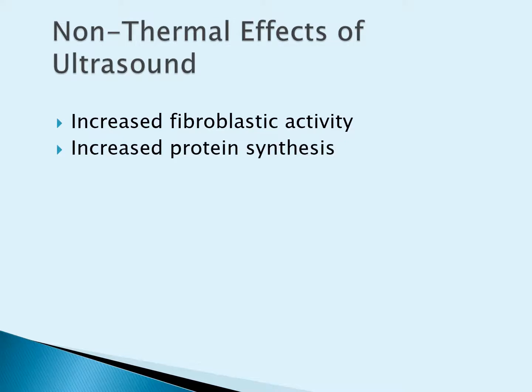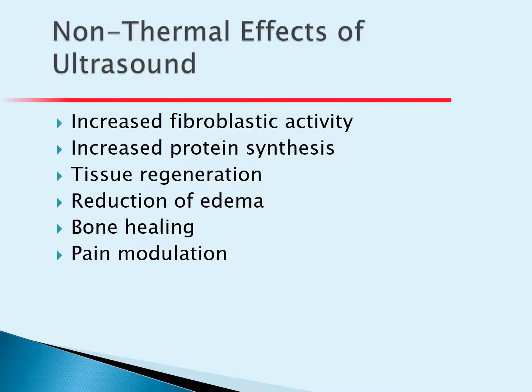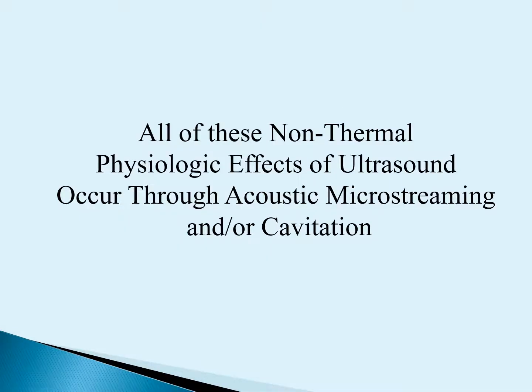Increased fibroblastic activity, increased protein synthesis, tissue regeneration, reduction of edema, bone healing, and pain modulation are all examples of non-thermal effects of ultrasound. When you're dealing with these non-thermal effects, it typically is caused by the actual sound waves themselves propagating through the tissue. What that means is it's going to excite those mitochondria and help everything.